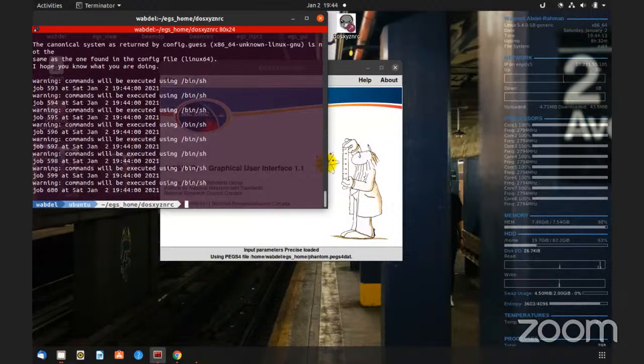So how is it going with you, Bilal? Any progress? Any projects? I actually have a few questions to be raised regarding the clusters. I'm helping someone to model a total skin electron beam. I learned a few things, actually. So I now know how to, for example, tilt the gantry in the simulation with different weights and so on. Anything interesting, anything regarding brachytherapy?